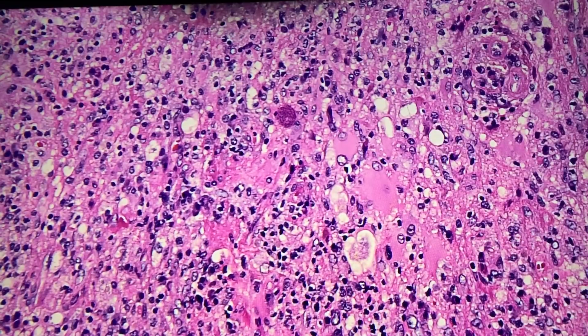Erica, you want to tell them the basic features? Yeah, so this is the encysted form of toxoplasmosis. So you get these somewhat pretty big cysts with these little bluish kind of granule looking things inside of them. So this is characteristic of toxo infection, and the inflammatory reaction that we see is very characteristic of toxoplasmosis. And it can be worrisome looking because it's very cellular. There are areas of necrosis, but you don't want to mistake this for a neoplasm.